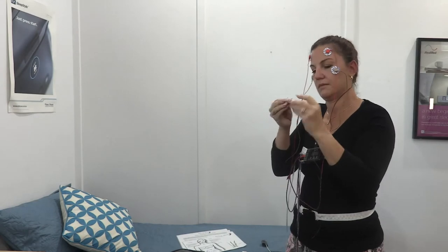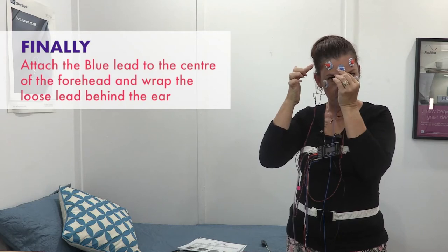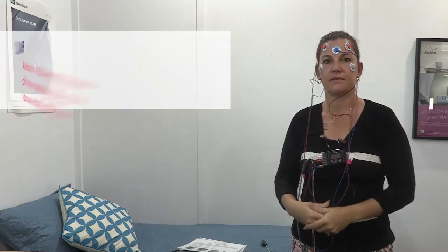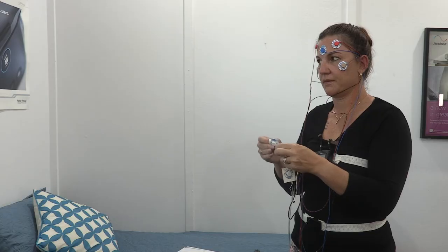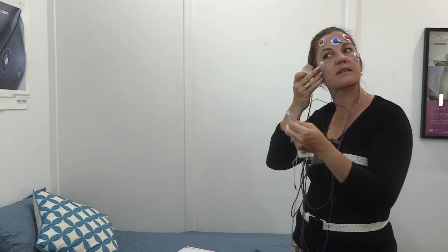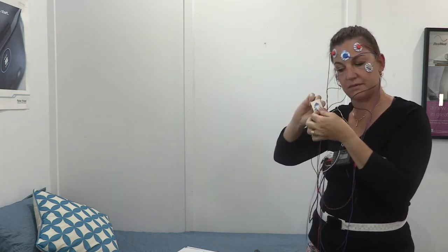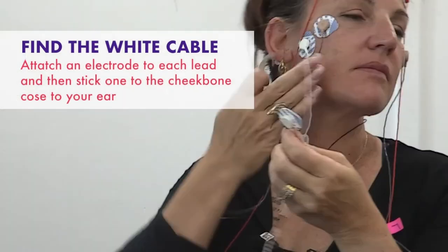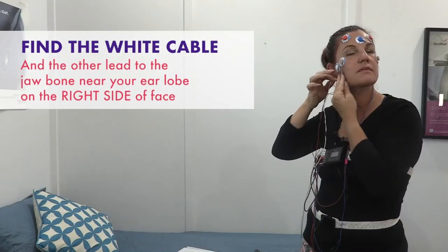Repeat on the other side. Finally, attach the blue lead to the centre of the forehead and wrap the loose lead behind the ear. Step six: placing the EMG cheek electrodes. The EMG sensors will tell us if you are grinding your teeth, clenching your jaw, talking in your sleep or have any other abnormal muscle activity. Find the white cable and attach an electrode to each lead, then stick one to the cheekbone close to your ear and the other to the jawbone near your earlobe on the right side of your face. It doesn't matter which one goes where.